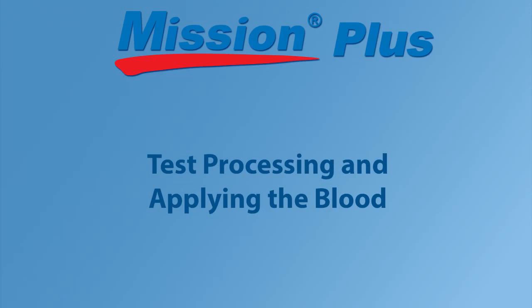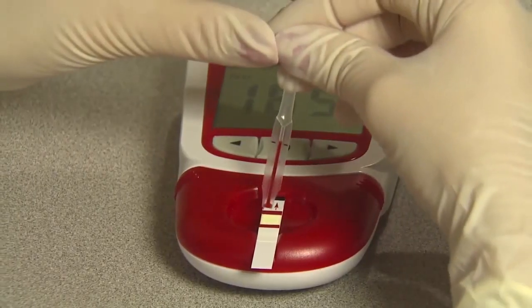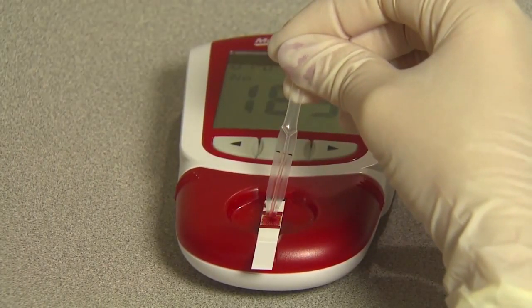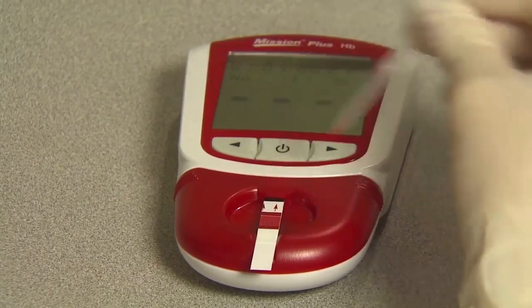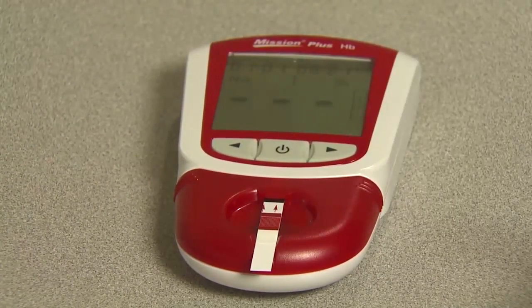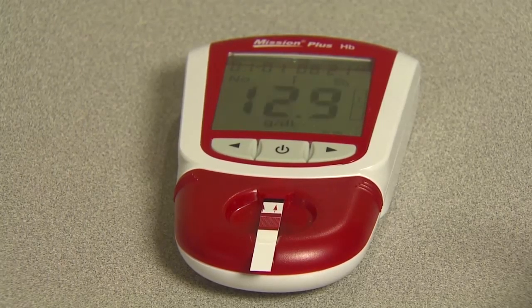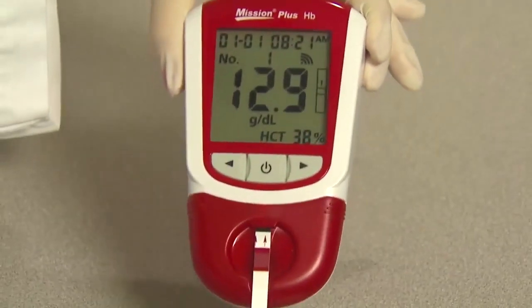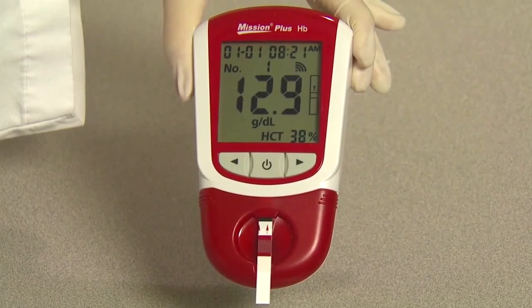Test processing and applying the blood. Apply the blood sample to the center region of the specimen application area of the test device or test strip. The meter will begin testing automatically with 3 dashes in a line flashing on the display, indicating the test is in progress. Results will be displayed in about 15 seconds with HCT value displayed at the bottom of the screen.